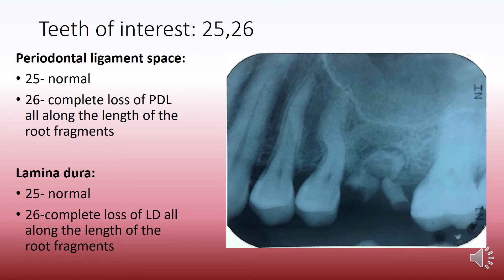The periodontal ligament space in case of 2-5 is completely normal even though the root is dilacerated. In relation to 2-6 we see that there is complete loss of the periodontal ligament space all along the length of the root fragments. When speaking about lamina dura, again in case of 2-5 it is normal, whereas in case of 2-6 it is completely lost all along the root fragments.